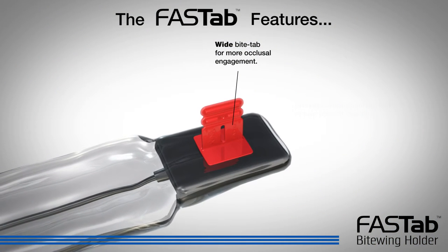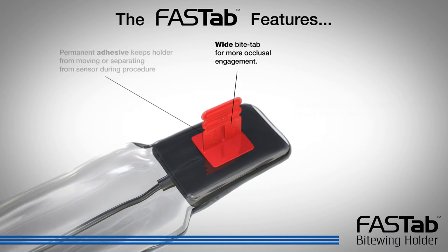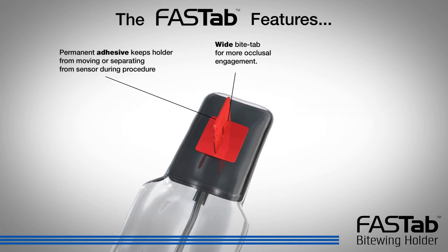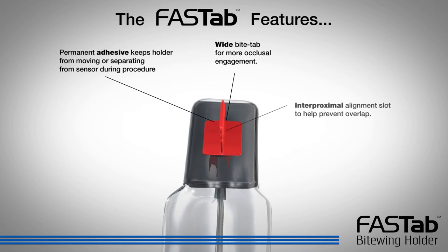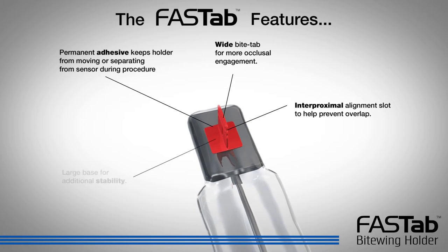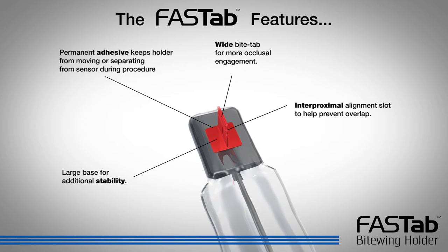The wide bite tab provides more occlusal engagement. Permanent adhesive keeps the holder from moving or separating from the sensor during the procedure. The interproximal alignment slot helps prevent overlap, and a large base provides additional stability.